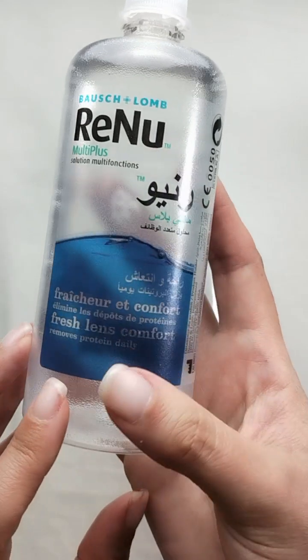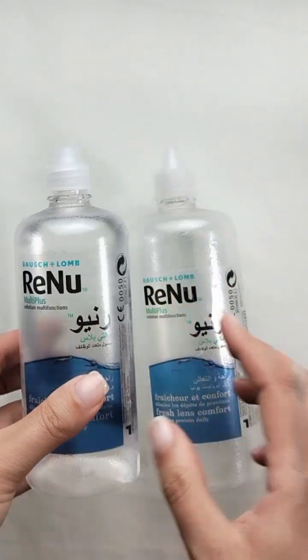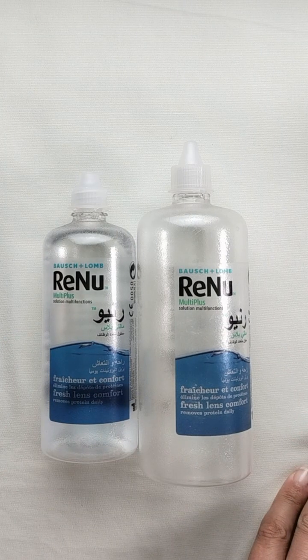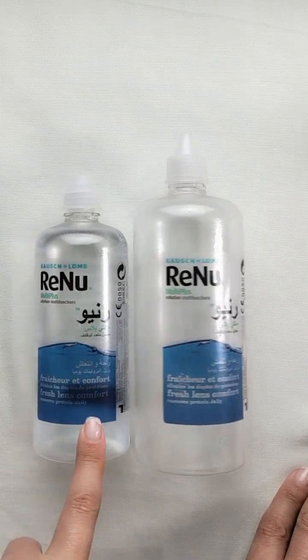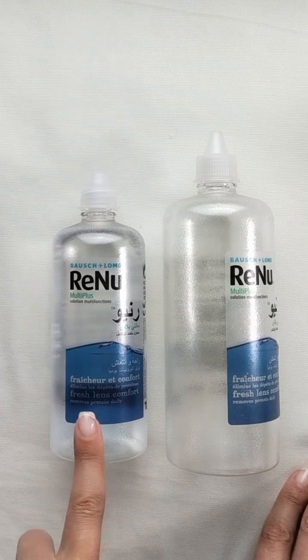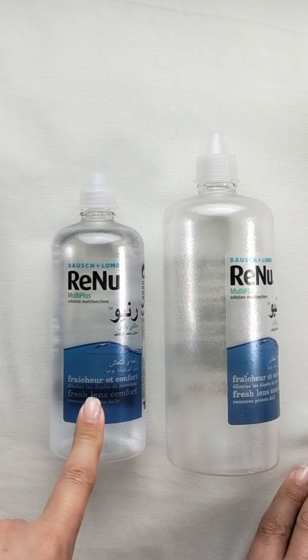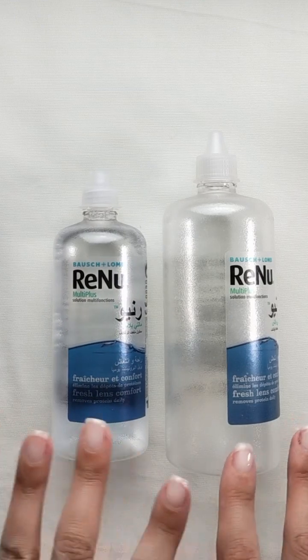The label says 'fresh lens comfort, removes protein daily.' I always change the contact lens solution — if I don't use the lenses every day, I still change it every second day, that's why I always have the bigger size. Every time I wear them I put them in a new solution. I never put my lens back into the same used solution. Always change it — that's why I use a lot of it.